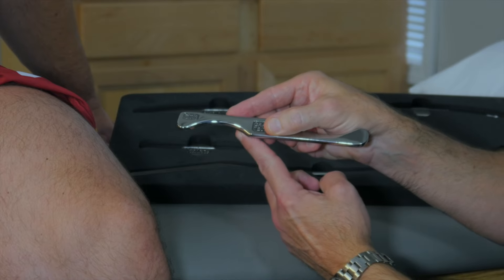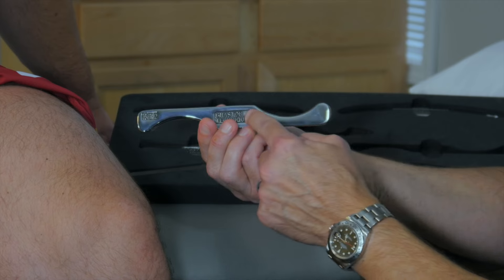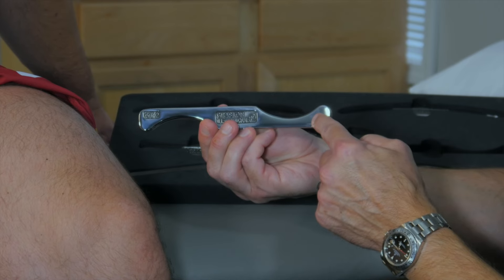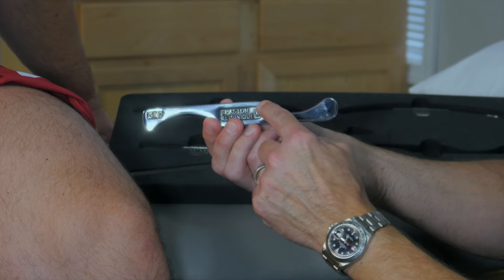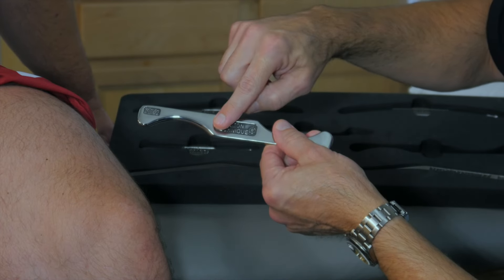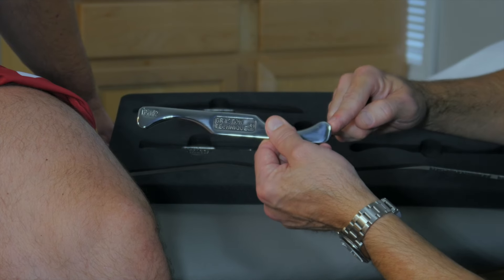We have a single-beveled concave edge on one side of the instrument and a double-beveled concave edge on the other side of the instrument. Also, where the edge meets the handle, you get a convex angle here and here, as well as convex knobs here and here.